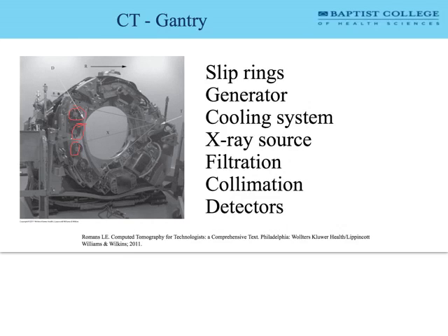Now, within the detector array, there's interspace material between each little tiny detector element. That interspace material can collimate the beam to some degree. It can almost function like a grid that we use in X-ray systems. We'll talk about that in just a minute. But just understand that the size of the detector element is called the aperture, and the smaller that detector is, the better the spatial resolution will be.